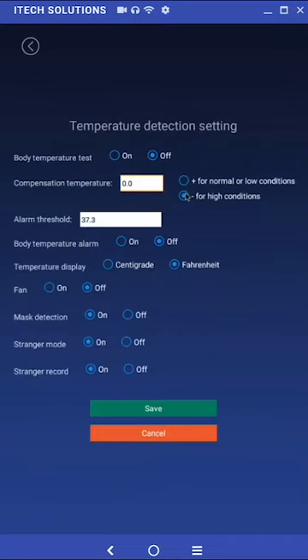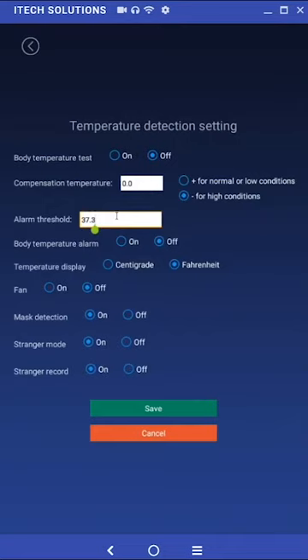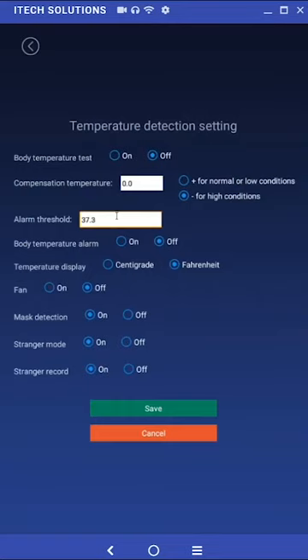Alarm threshold. At this time, this setting can only be set in Celsius. The default setting is 37.3 degrees, which is approximately 99.1 degrees Fahrenheit. This is the temperature that will trigger the alarm to activate if a user checks in whose temperature exceeds this threshold.